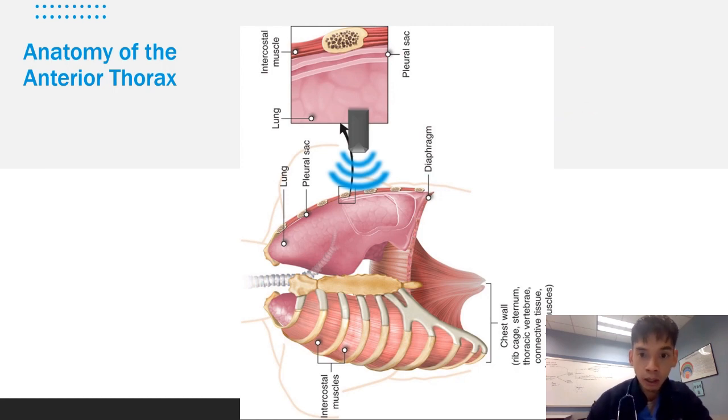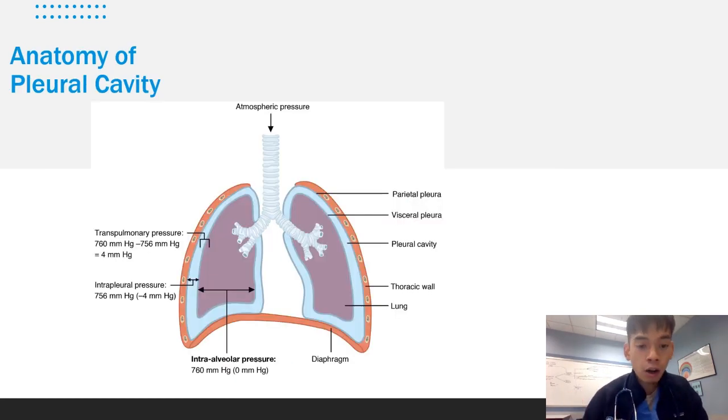So let's go ahead and move on. And here's a cartoon drawing of a pleural sac again.